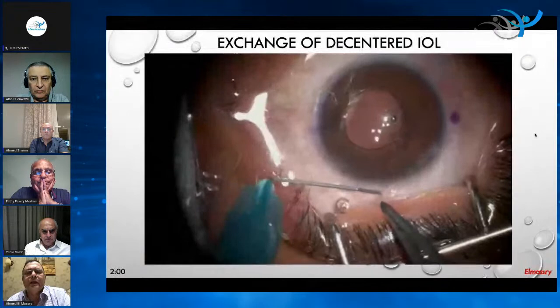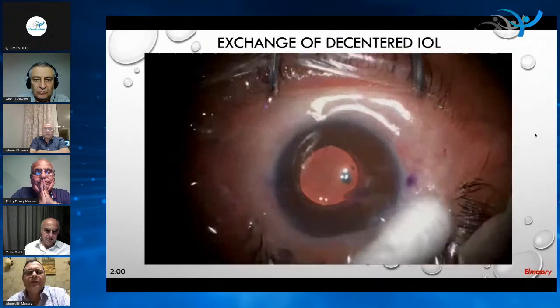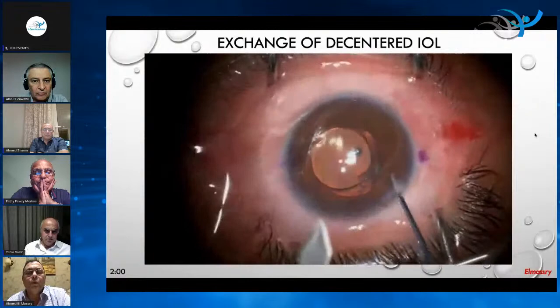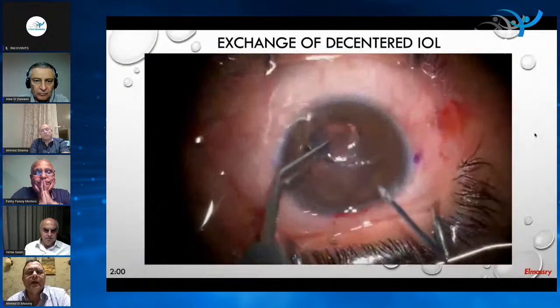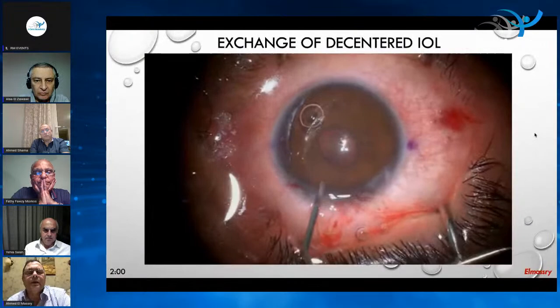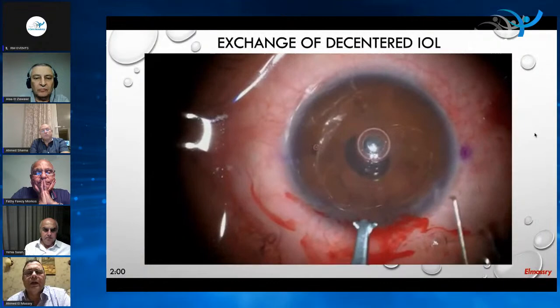So delivering the lens in the anterior chamber, the patient received some subconjunctival anesthesia because he was a little bit in agony. And because you're gonna open the wound, it's very important to know when to put the anesthesia, because once you open the globe, it will be a little bit difficult. Holding from one side and getting the lens out, be sure that there is no vitreous in the anterior chamber. The pupil had been constricted, it's very regular, there was no vitreous, and inserting your Verisyse or Artisan IOL in the anterior chamber, holding with the special forceps.